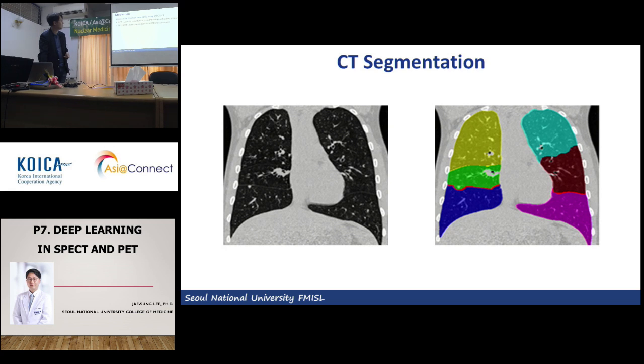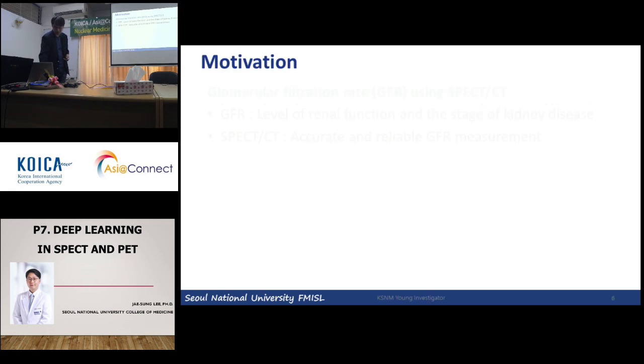Personally, I think this is very valuable, but it takes a really long time. For example, in our school, at SNU Bundang Hospital, we are using SPECT/CT for quantitative evaluation of GFR by drawing the volume of interest onto the parenchyma of the kidney.